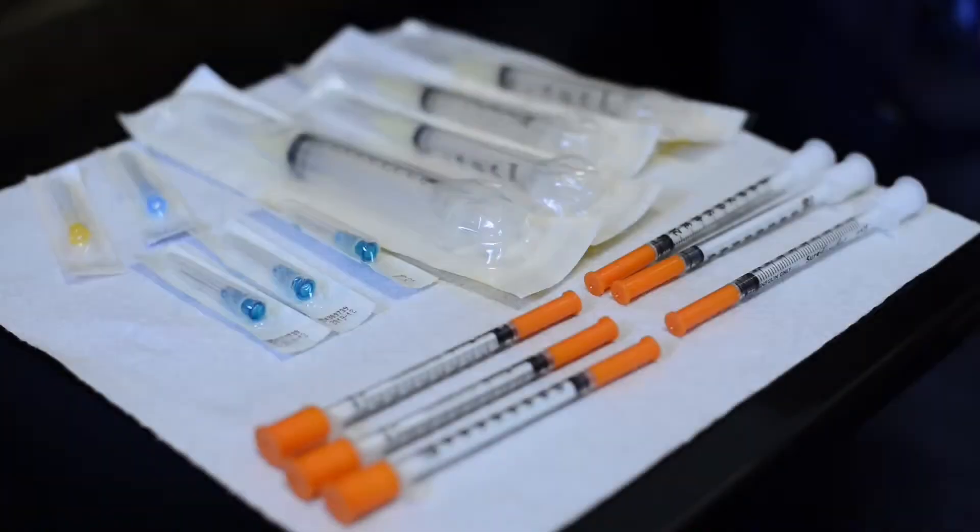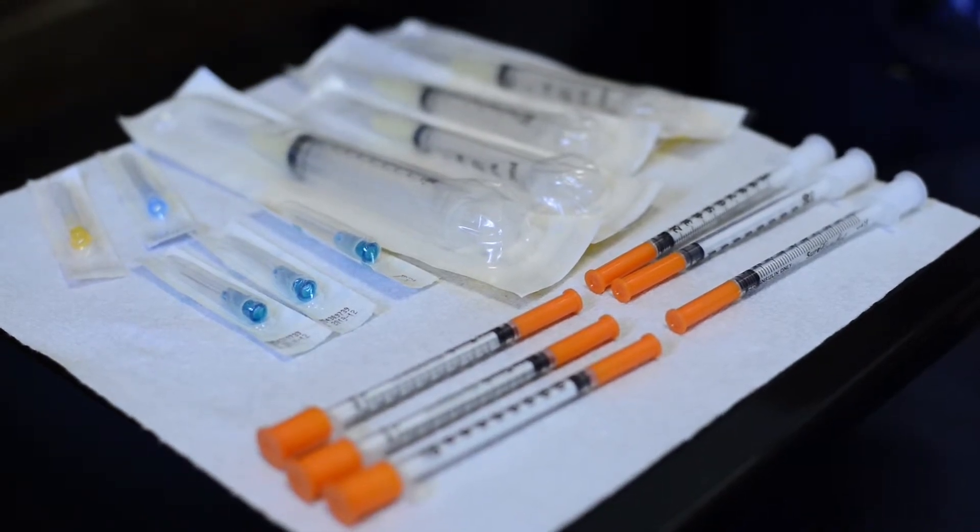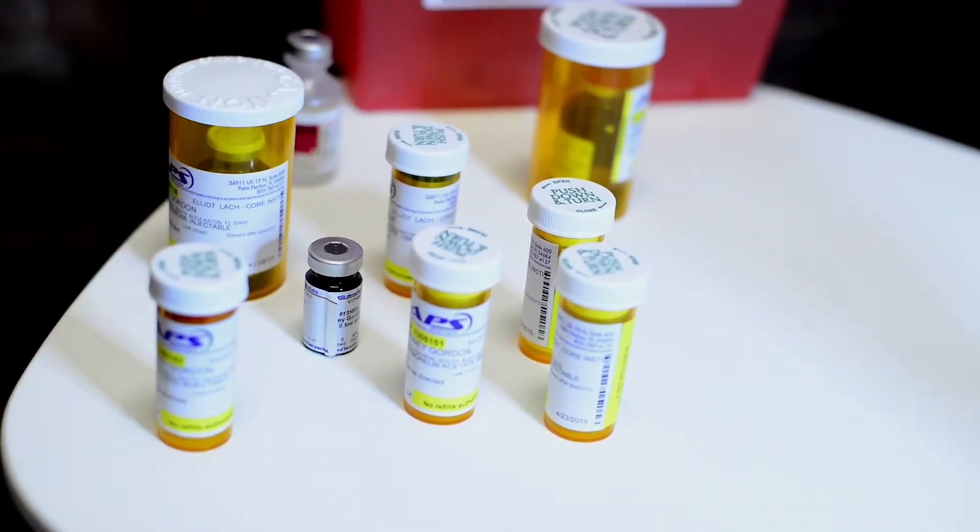The first thing you're going to see is — in some situations people feel it's an overwhelming amount of medication and syringes, such as what I have on the table over here to the right. There are three different types of syringes and four different types of syringe lengths. To the left is a group of different types of medication, which by the end of these videos you will see mixing and injection on all of them.